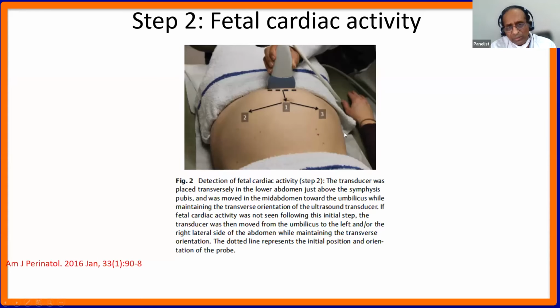Imagine the uterus is an enclosed space where you're not able to look directly. So you're using the ultrasound as a torchlight to look into it. So you use your probe. By moving your probe systematically, consistently in the same manner, you will not make any errors or mistakes.